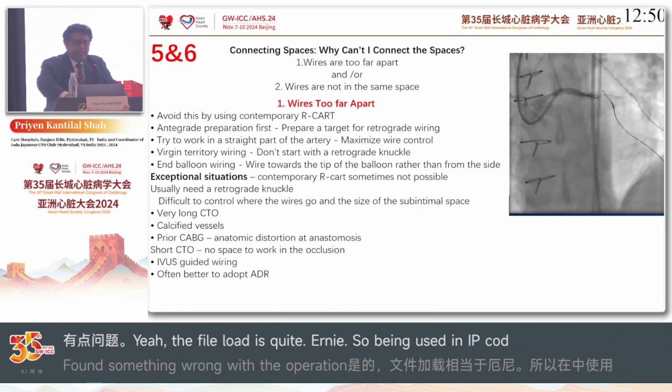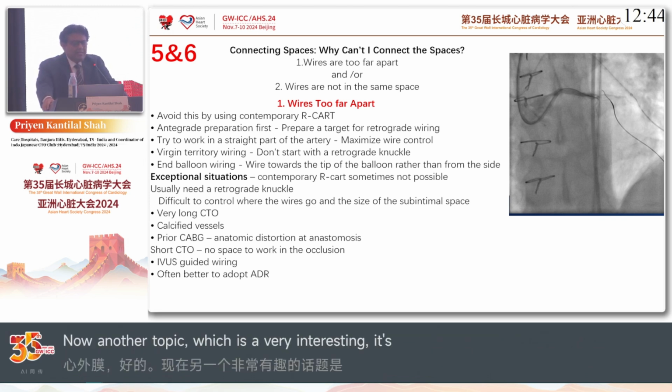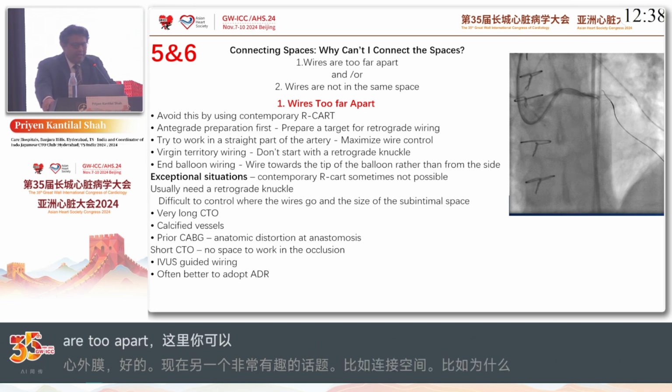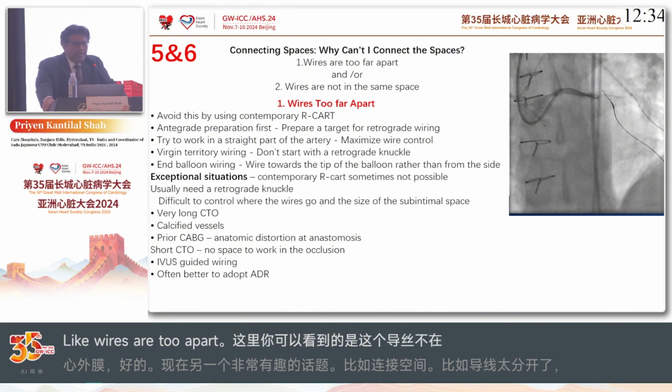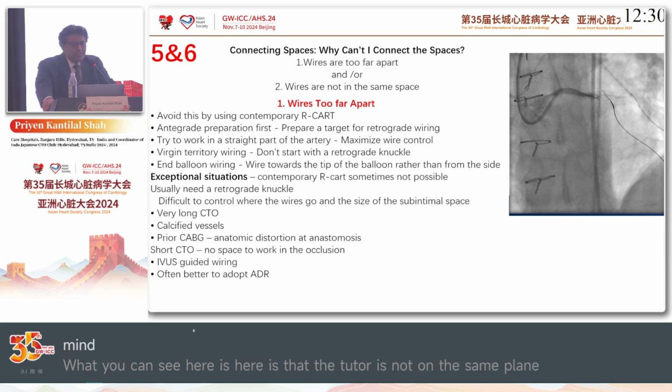epicardial. Okay. Now another topic which is very interesting is connecting spaces, like when wires are too far apart or not in the same plane. So avoid this by using contemporary reverse CART. Antegrade preparation should be well in mind. Try to work in a straight part of the artery.